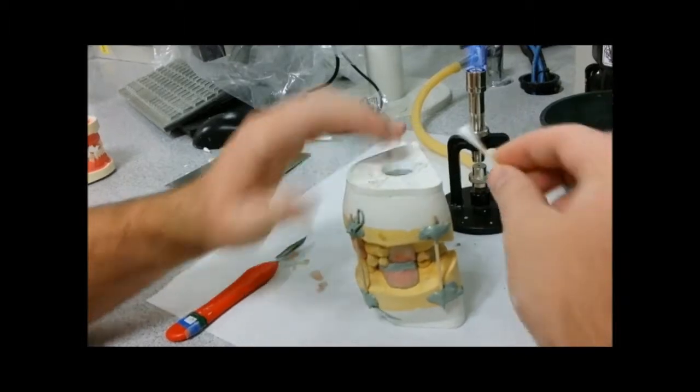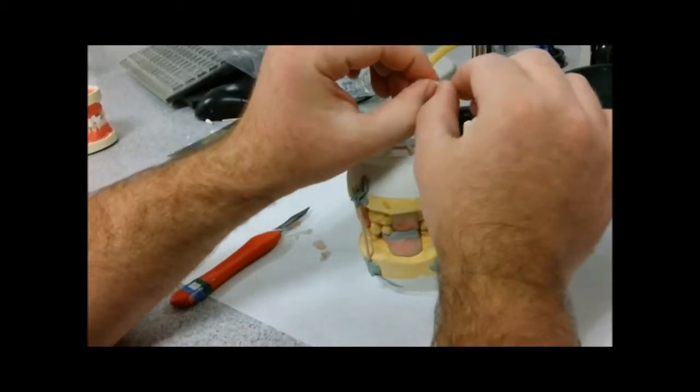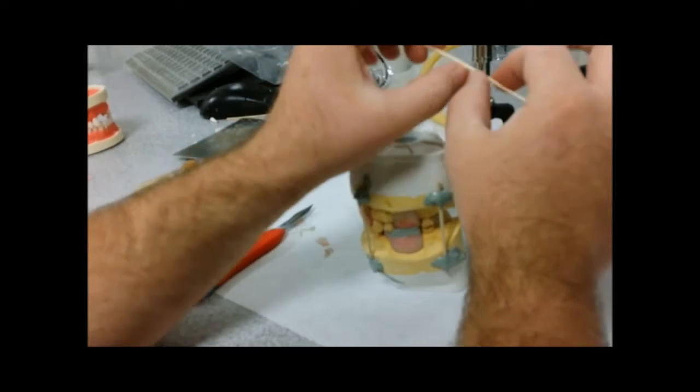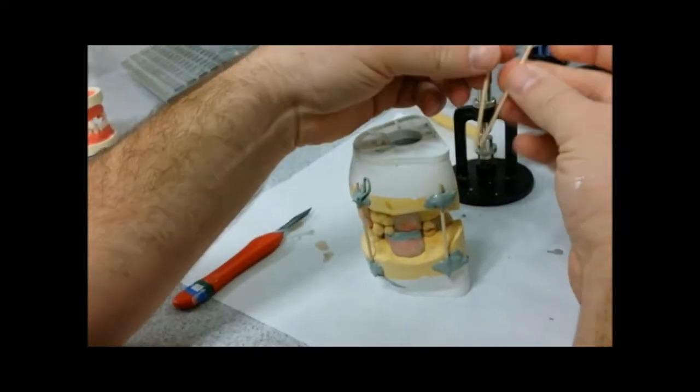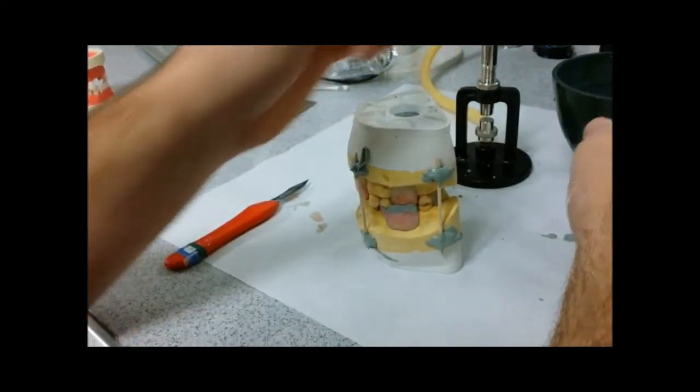And if you want to be cheap and easy, you can use the little cotton tips, these. In order to do it, you just break off the tip then go down, break it halfway in between.